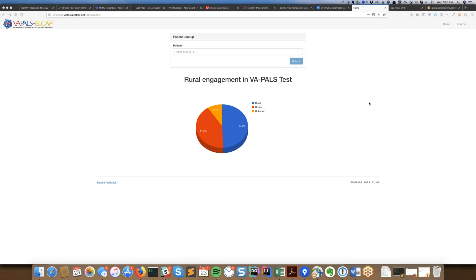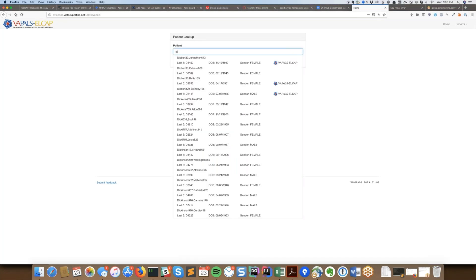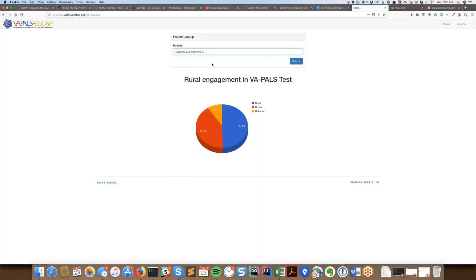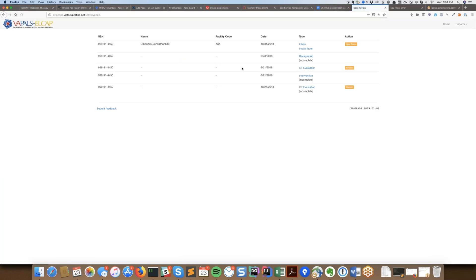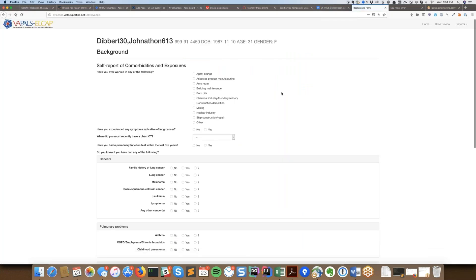I've already started sharing my screen so you should see the main page for the VAPALS LCAP project. We went over this a little bit last time with the pie chart and everything, but I'm going to jump right into the background form. It has changed a little bit since the last time we went through this. It's been so long it's hard to remember exactly what changed, so I'll go through the whole form, and feel free to jump in with questions.